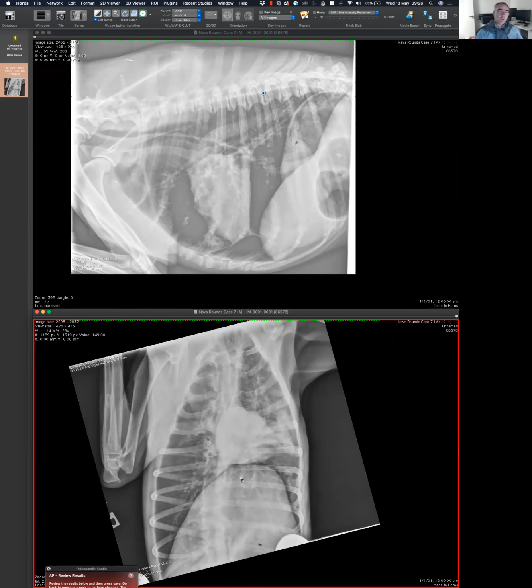So I would put all of those features in a bag and then probably conclude that the thing that makes more sense is that we are overexposing. So that would be my argument. I don't know if you want to get back on me or argue again.